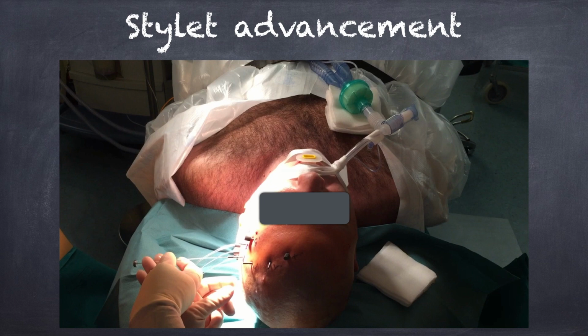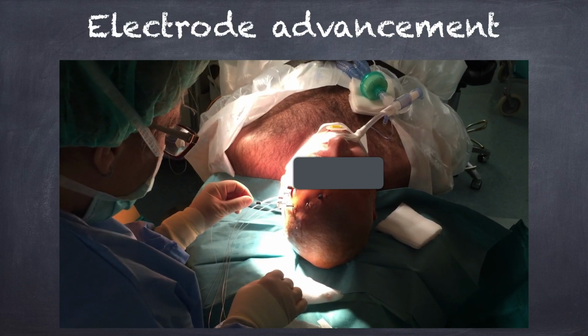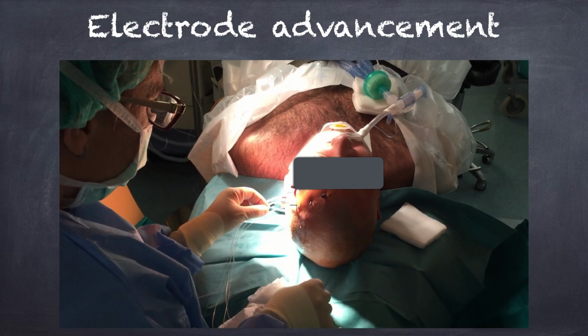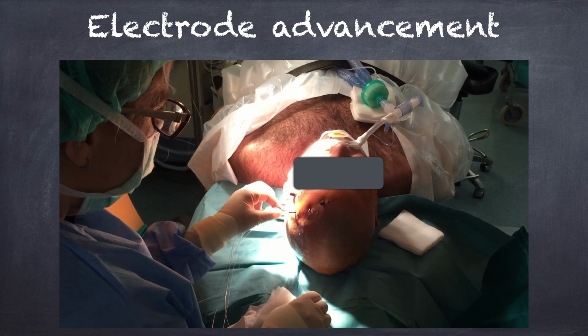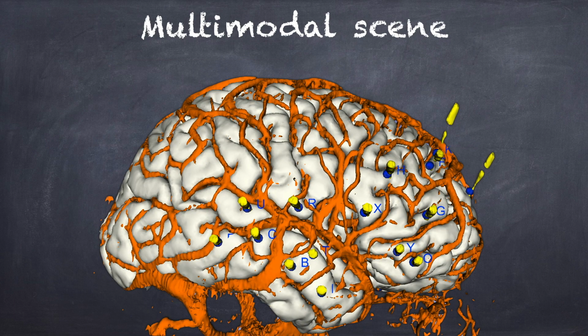First, a rigid stylet is advanced all along the trajectory. Next, the stylet is replaced with the multi-lead recording probe. Finally, a post-implantation CT is obtained and registered to preoperative images. Multimodal scenes are then helpful to assess the correct position of every recording lead.